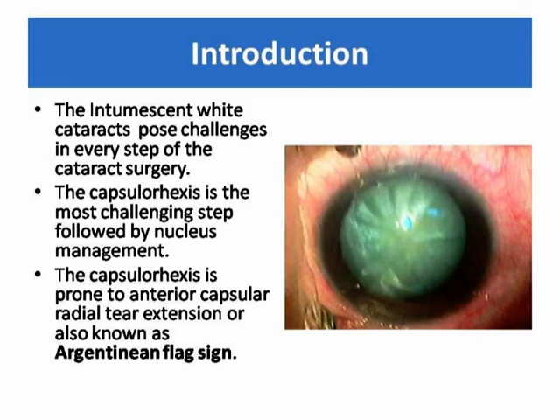Intumescent white cataracts pose challenges in every step of cataract surgery. The capsular rhexis is the most challenging step, followed by nucleus management. The capsular rhexis is prone to anterior capsular radial tear extension, also known as Argentinian flag sign.